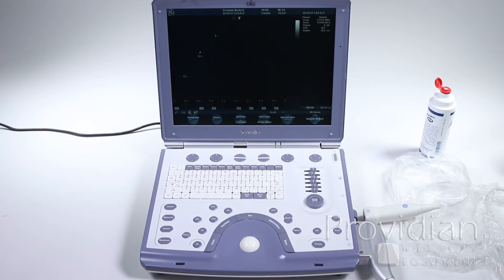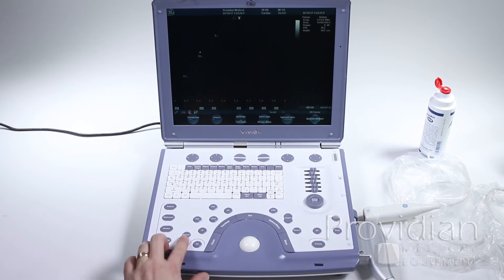For Doppler and M-Mode imaging, I'm going to start with M-Mode, but something fairly unique to the GE machines that not a lot of machines have is this cursor.